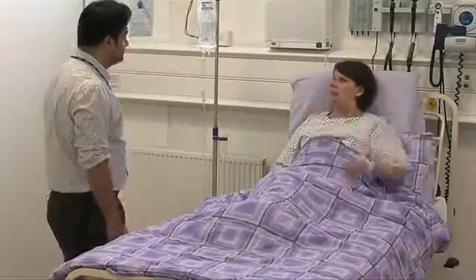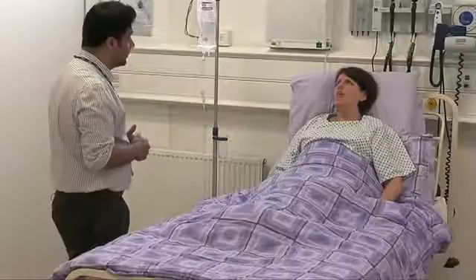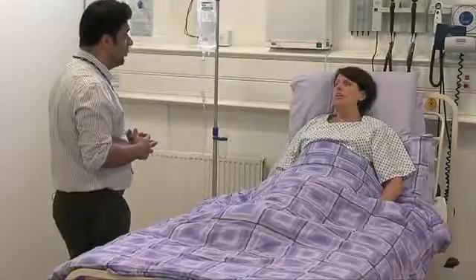and then we'll take it out later in the future. Because I've been having all these flus and my bladder feels it's up to there. You've had an operation. That's one of the complications of having difficulty in peeing after an operation. Oh, right, okay. Like I said, it's slightly uncomfortable. We'll give you a slight clean around the water pipe, insert the urinary catheter in, and hopefully the pain will ease off after that. Oh, I hope so. Would that be okay if we proceed? Yeah, that's fine. Okay. Thanks. What I'll do, I'll get everything set up on the trolley. Then I'll come back through. Will you be long? No, it won't be long at all. Oh, great. And we'll take it from there.